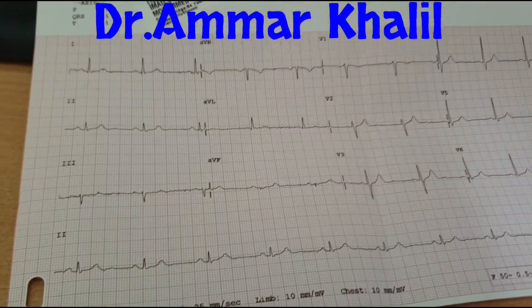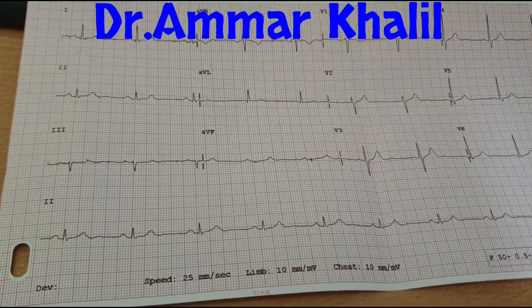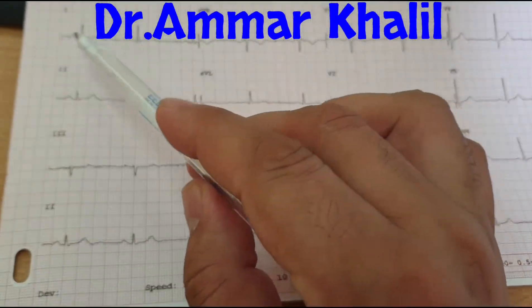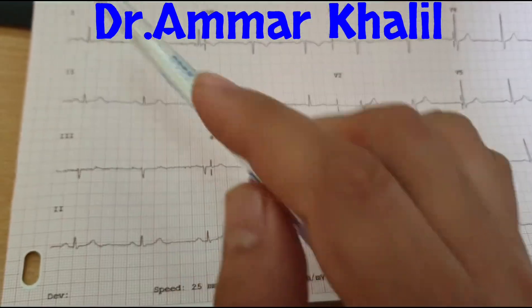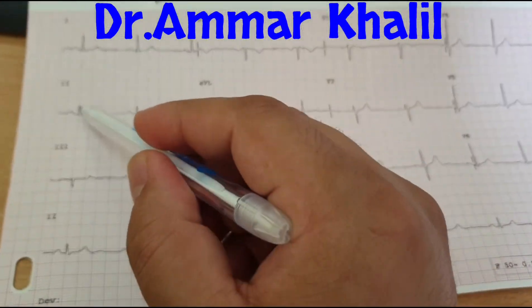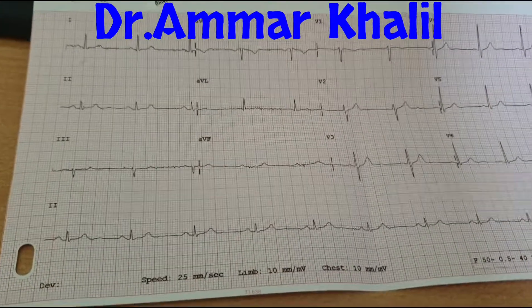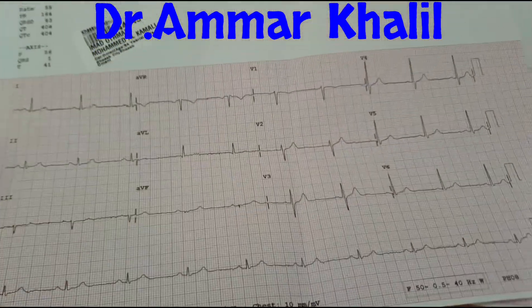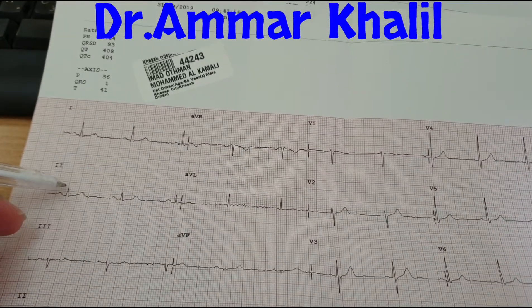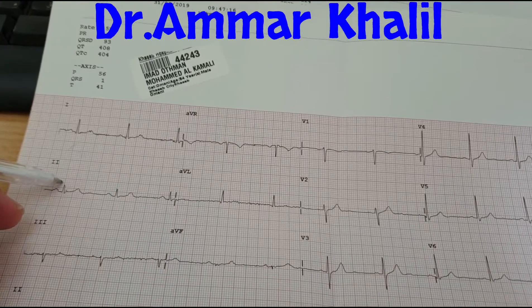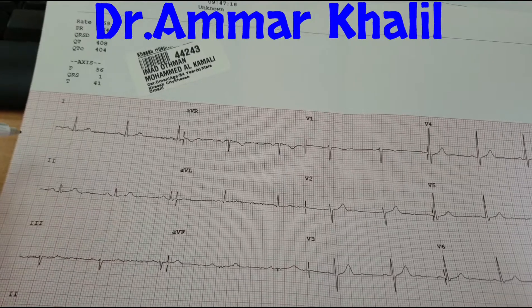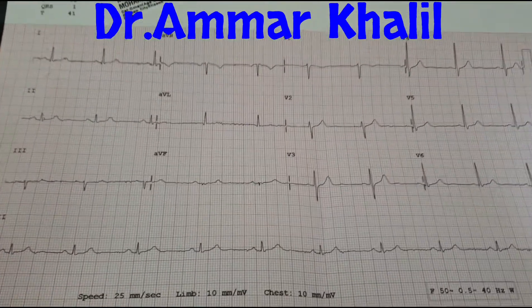This ECG is for one patient. We are looking at lead one and lead two. You can see the R wave here — a positive R wave and positive R wave. That means it is a normal axis. This is normal axis.